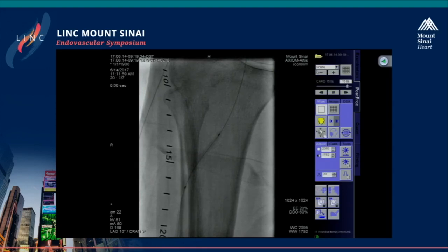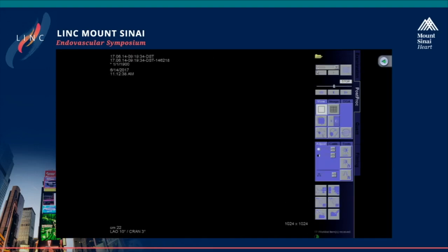For us, what we practice is trying to debulk to the point of a residual stenosis less than 40%. And then we use IVUS to measure the vessel. Obviously, we're not able to direct in either way. Second is obviously flow characteristics. If we have good flow characteristics, and we know that we're guttering into one side, especially with directional atherectomy, then we tend to stop.